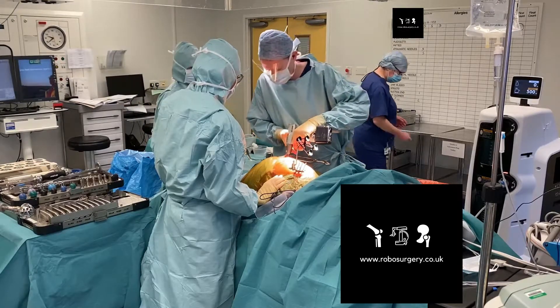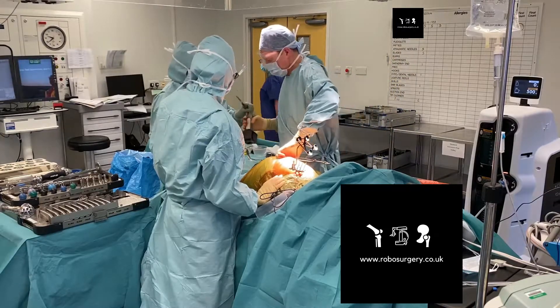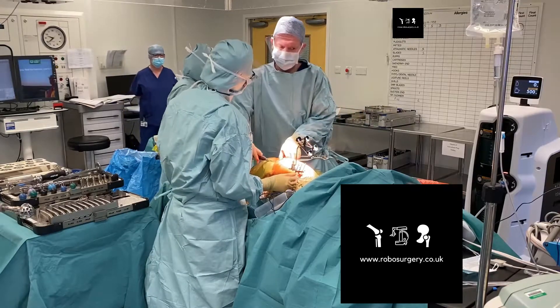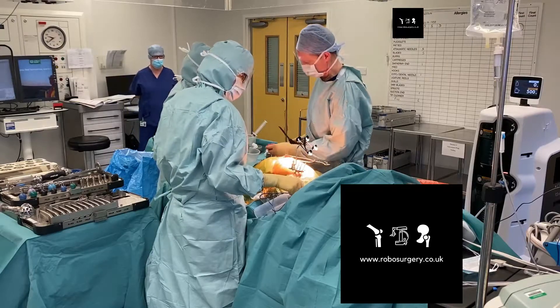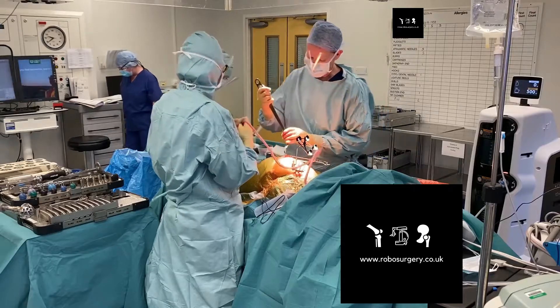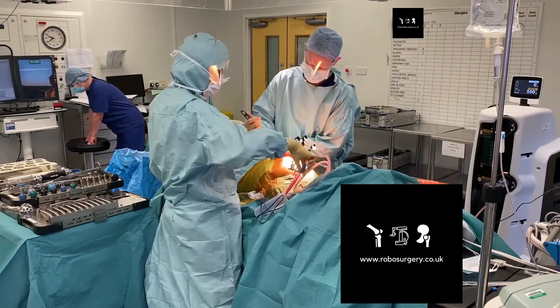Here we're cutting the femoral neck as you would do in a standard hip replacement procedure, just removing the head with an osteotome and then placing a retractor anteriorly.